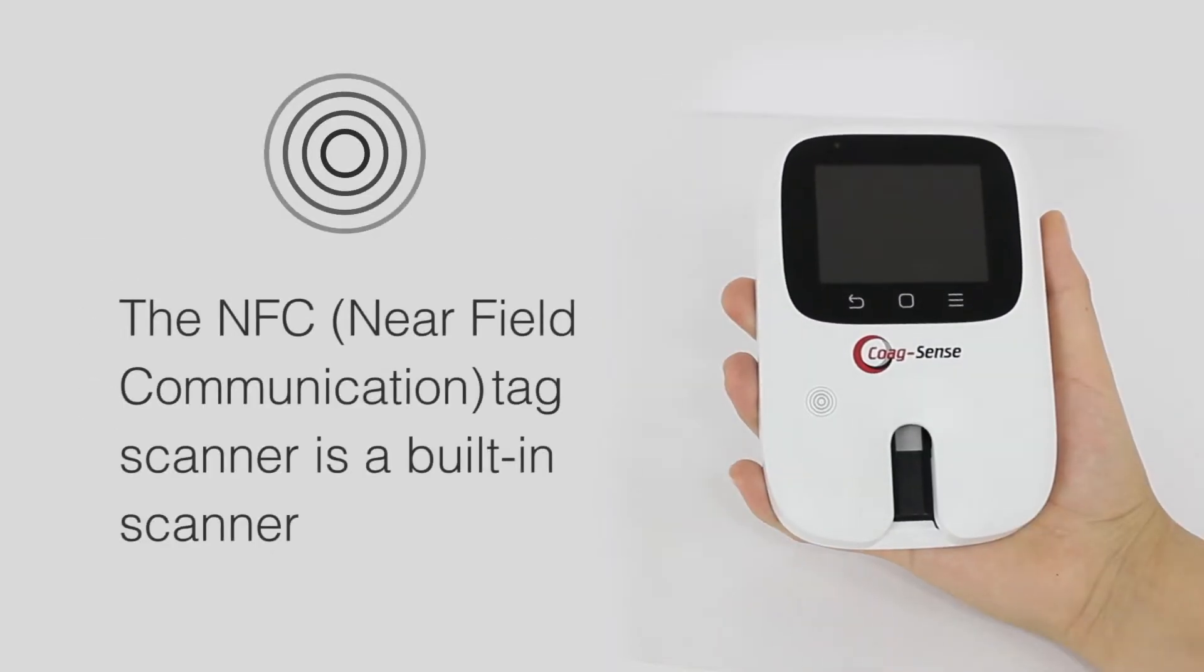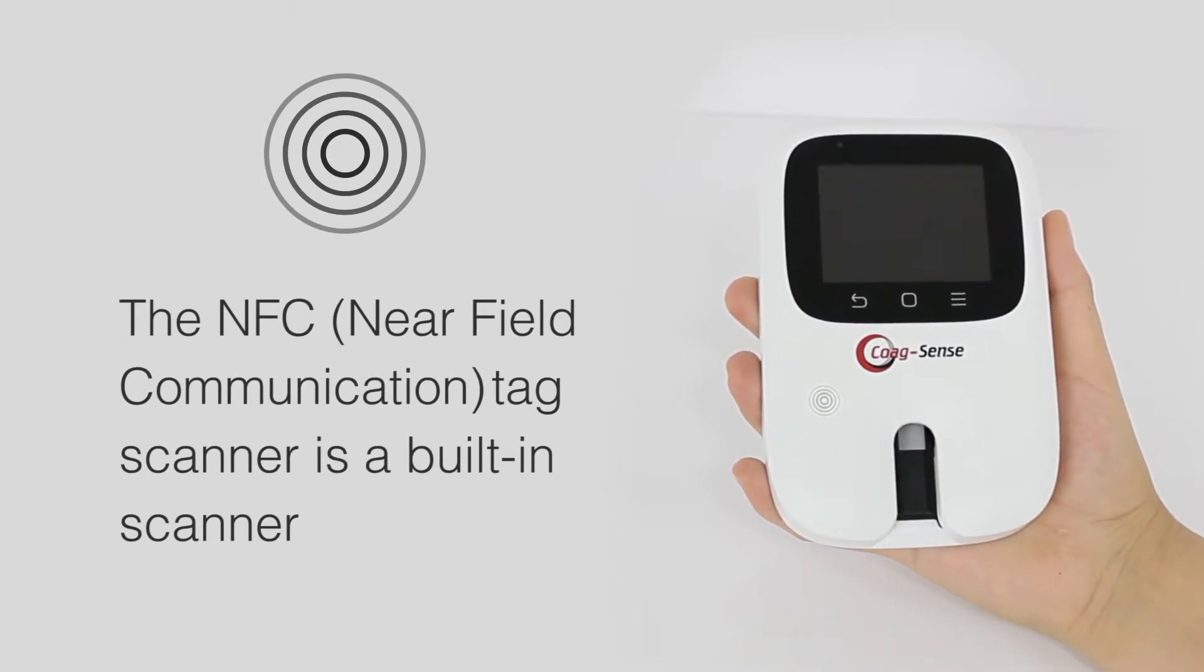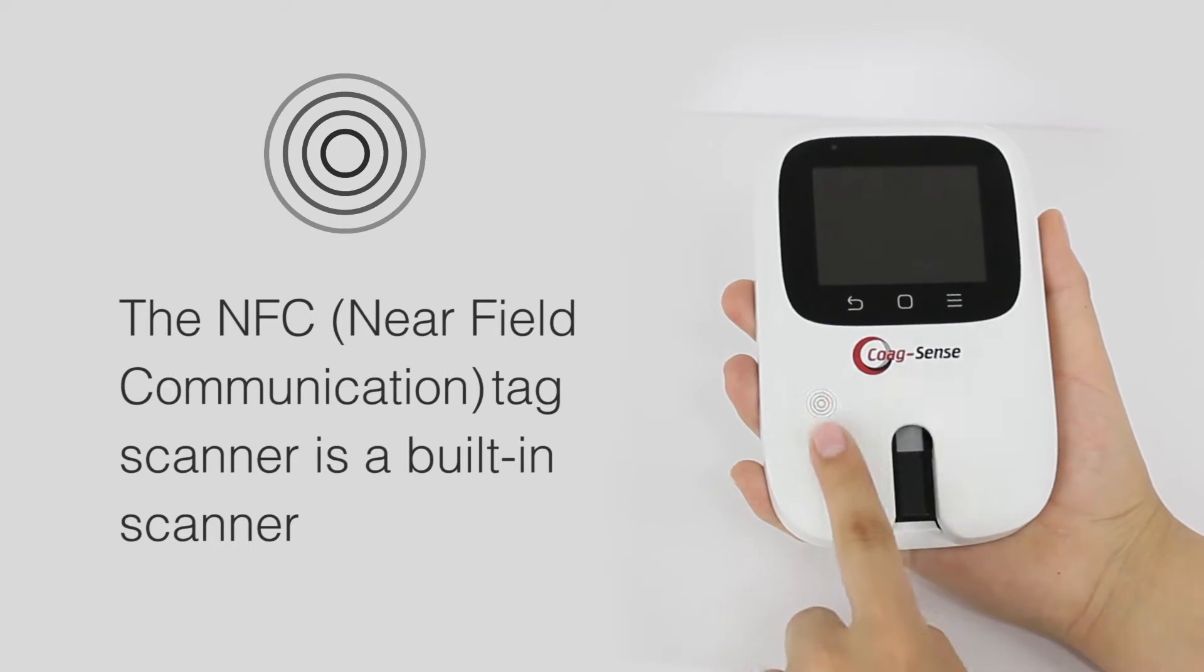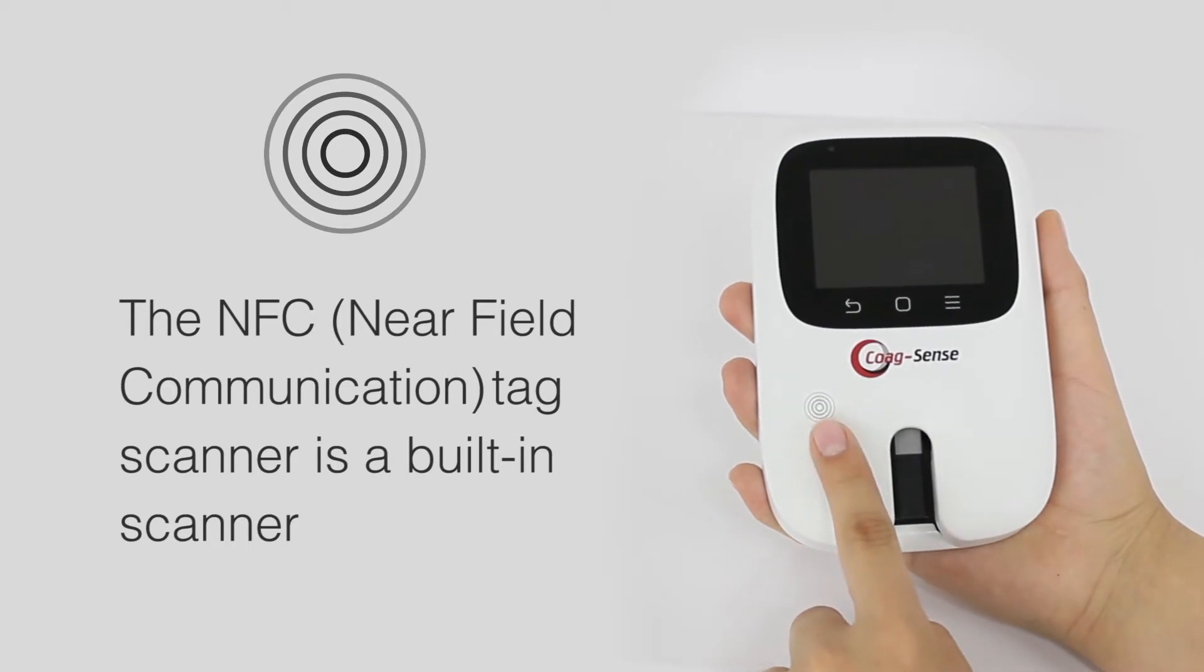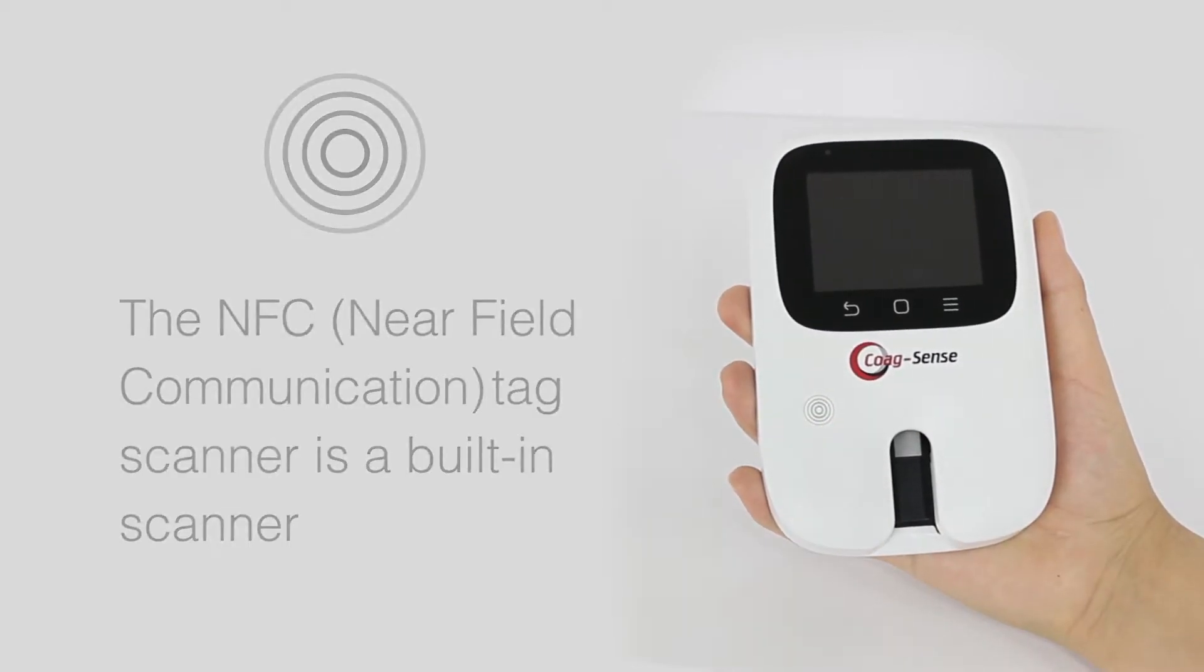The NFC Near Field Communication Tag Scanner is a built-in scanner that is used to scan the NFC card containing the strip, control, and test strip data.